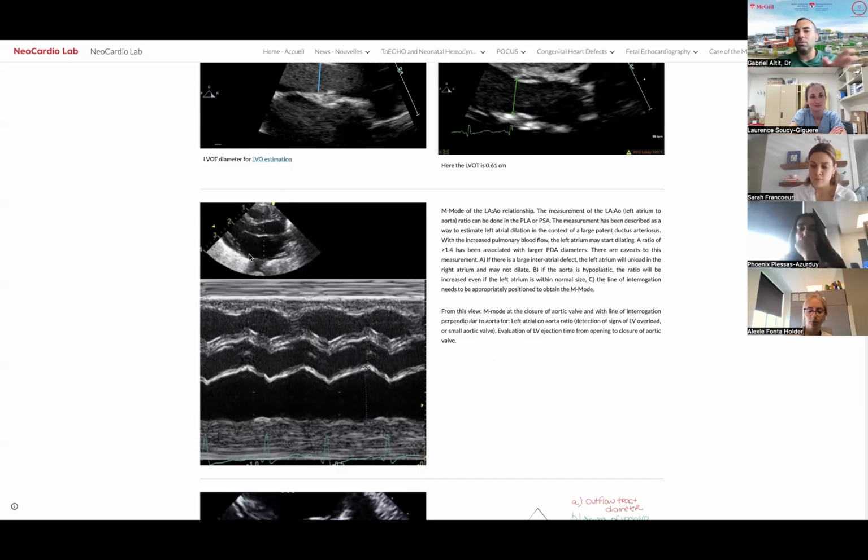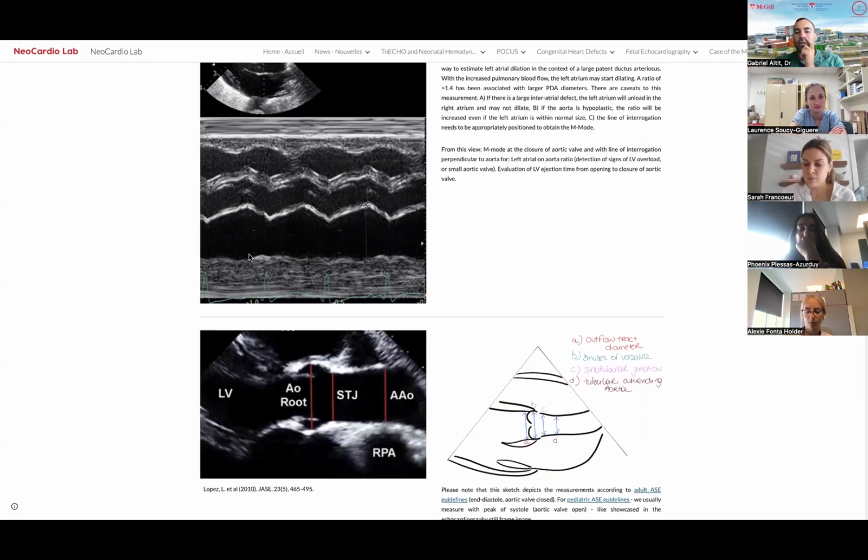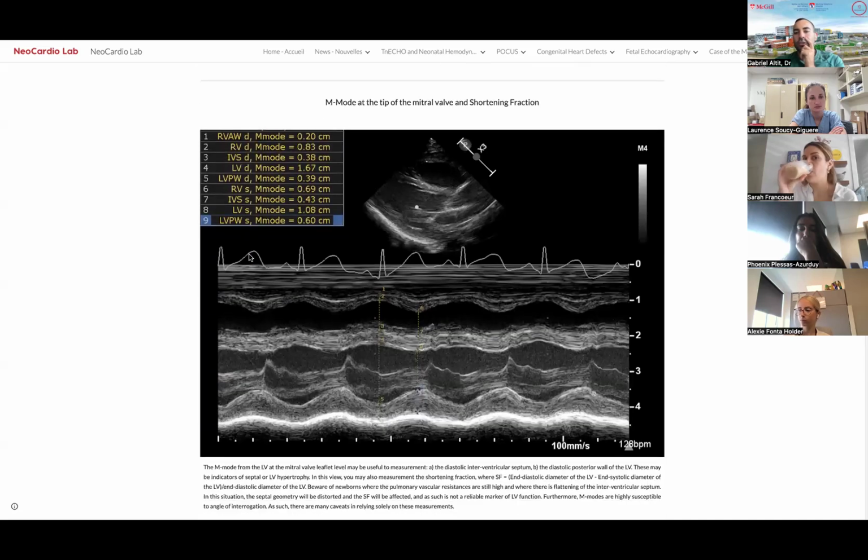That's not what they do in the emergency room. It just happens to be the convention in cardiology. And it's been traditionally that way.